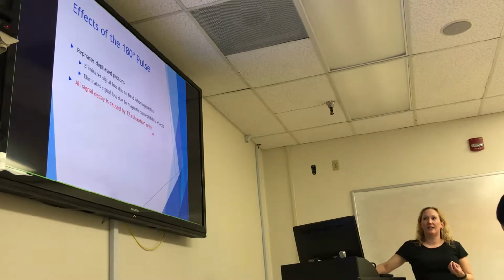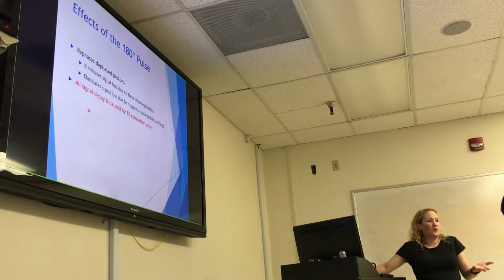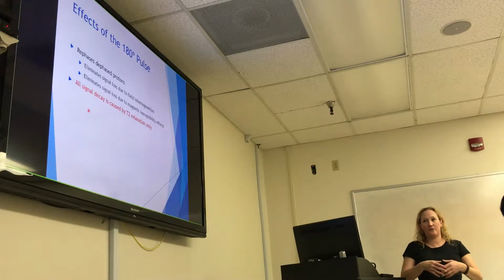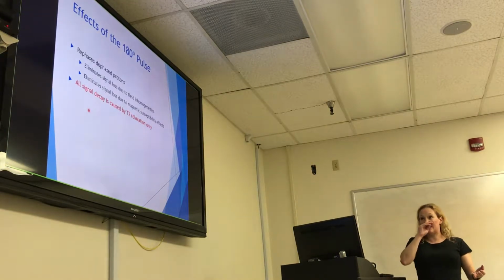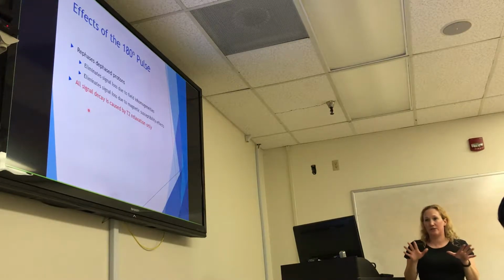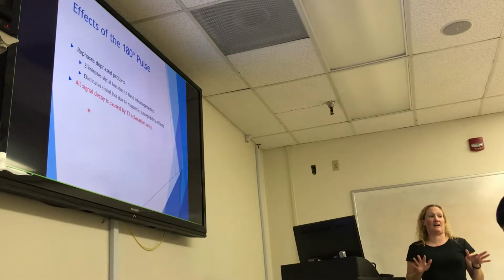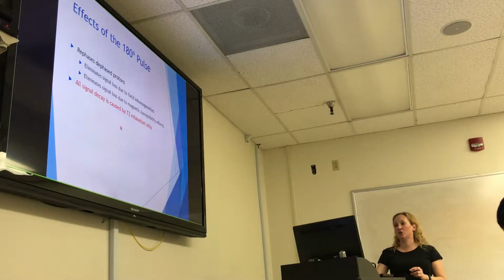Really important here is that it does not rephase spin-spin decay, okay? Our pure T2 spin-spin decay is lost forever, and that's what causes us to have contrast, right? If it rephased everything, then we wouldn't have any differences. And so it's not going to rephase that T2, which means all of our signal decay is caused by pure spin-spin, and that's what enables us to have contrast between our tissues, okay? So it rephases these two, but it does not rephase the pure T2.